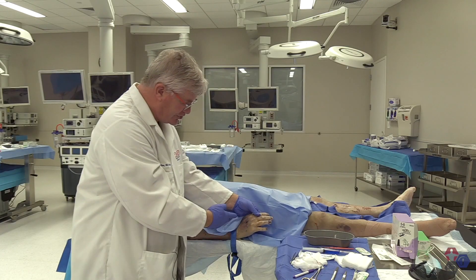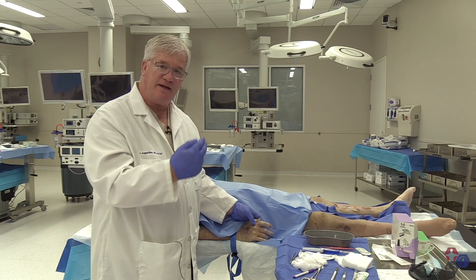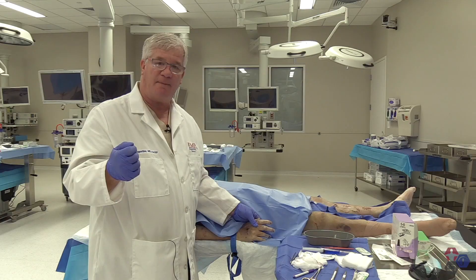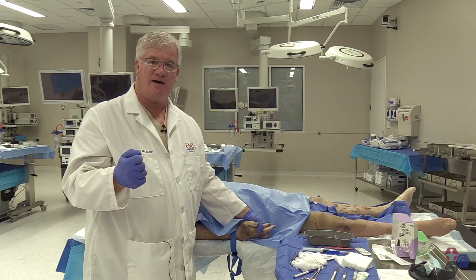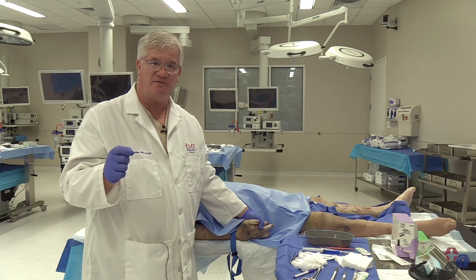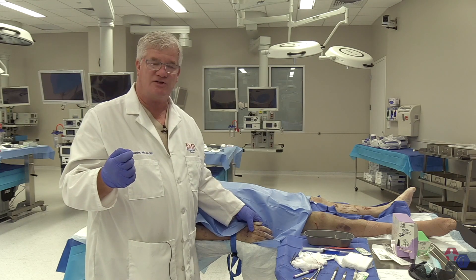For closure of the skin of the hand: on the dorsum, we have very little vascular supply, so any tissue that's already dead needs to be debrided to produce a good viable skin edge. On the back of the hand we can use vertical mattress sutures to keep the skin in good position. On the palmar side, there is relatively less use of vertical or horizontal mattress sutures — closure of the skin as appropriate minimizes the risk of long-term infection. We can also make use of Steri-Strips and other dressings that allow skin edges to come together loosely.